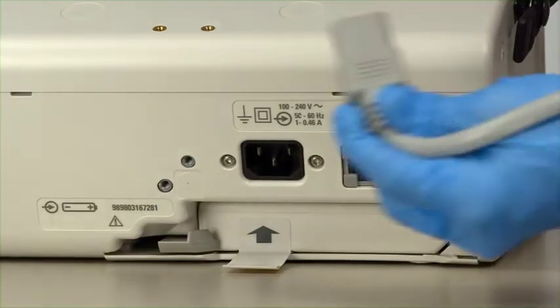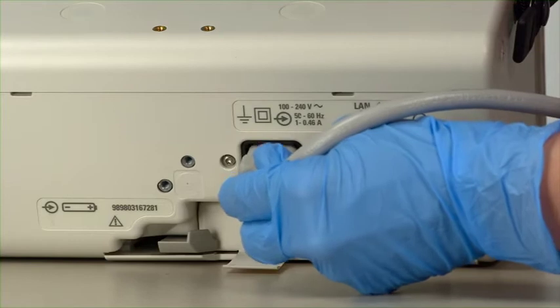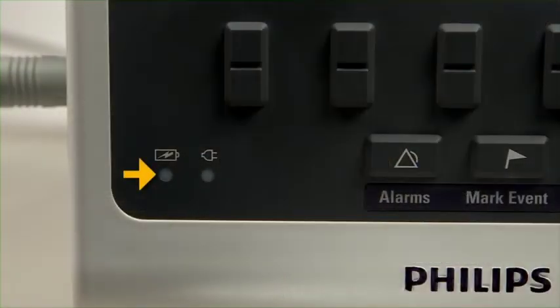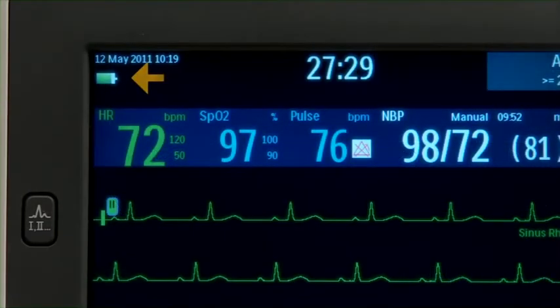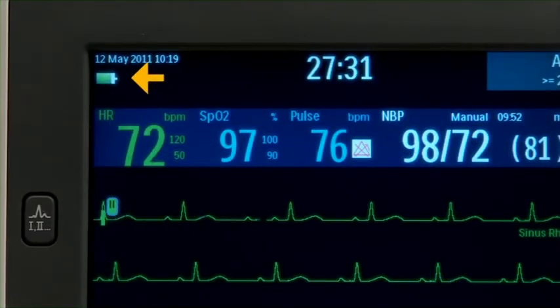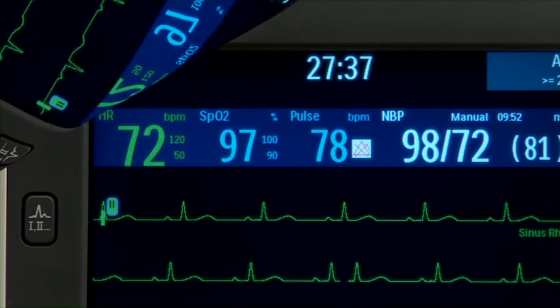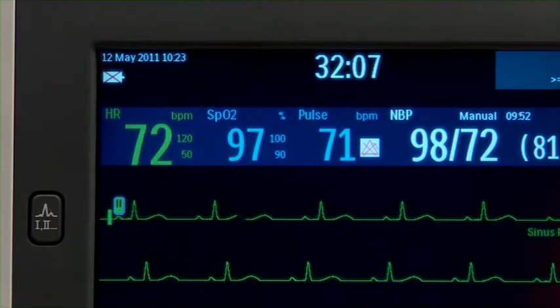Here is the AC power connection. Connect AC power to charge the battery. Once connected, this indicator lights to tell you the battery is charging. This screen icon indicates the presence of a battery. As the battery drains, the icon displays incremental charge levels. An X in the icon indicates no battery.